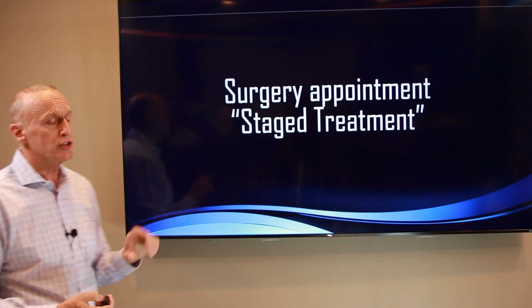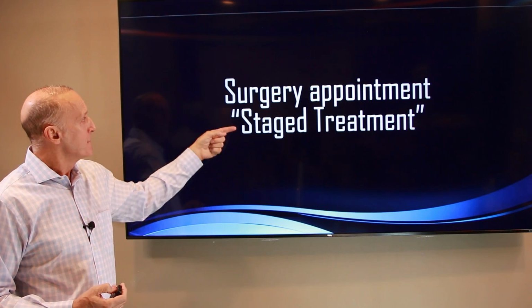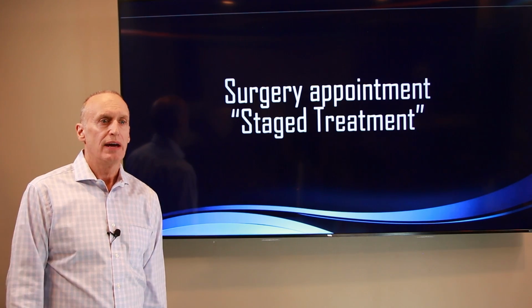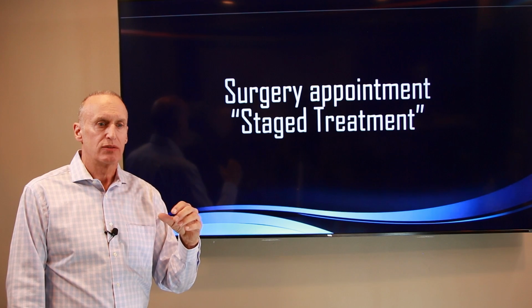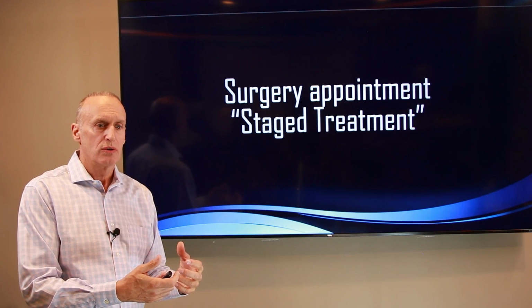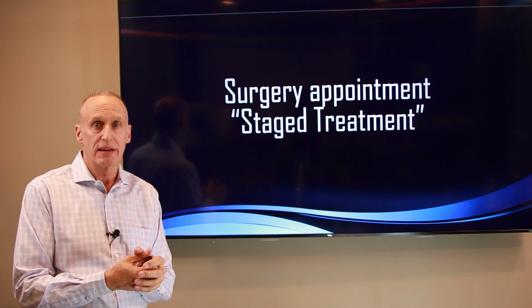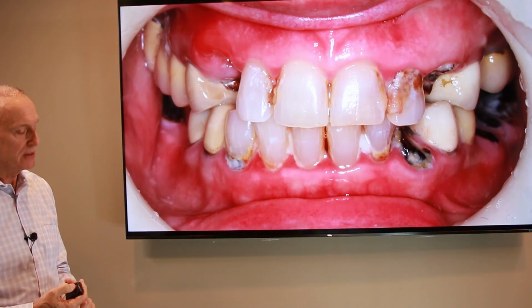But I'm going to show you the first case. You may have seen it before in my other videos. But in the last 2 years, I've come up with a way to do these treatments in a staged approach. And the reason is it yields a better result. It's my solution for patients who may not have enough bone density to get their first temporary on implants, but we don't want to give them a denture either. So let me take you through this, and I think it'll be a little more clear.